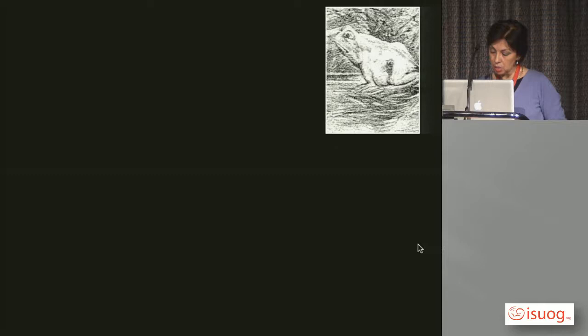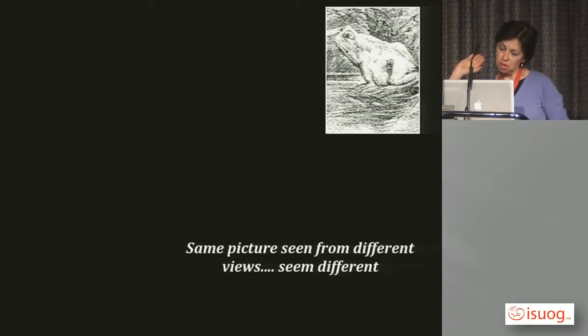Now, perhaps to me, one of the more important pitfalls is to learn how to look at the heart from different angles. And that applies not just for an atrioventricular septal defect. I think I've shown you that in some of the other lectures today. But what do you think this is? Right, so maybe we're putting our transducer in a certain position, but just remember that the same picture, if you look at it from different angles, it can look different. If you look at yourselves, or if you look at me, people look different, even if you're looking at the same structure.